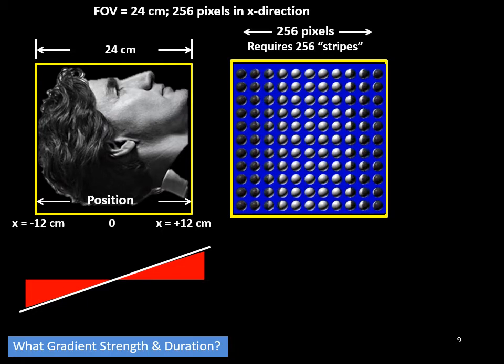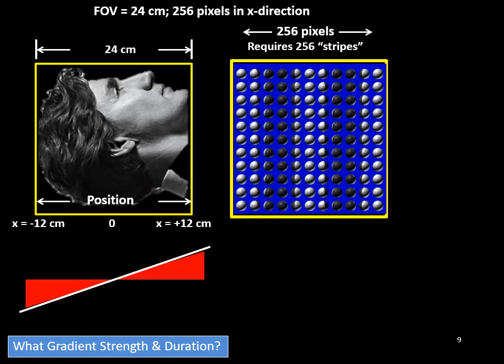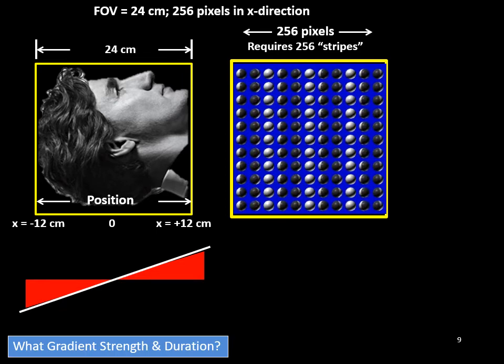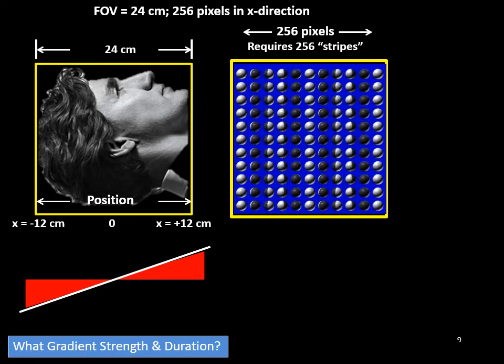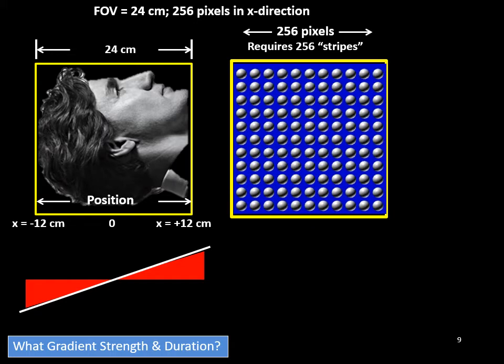It doesn't rotate. But to get 256 lines across the image, we would have to have the spinning ball on the extreme left of the image rotate 128 times relative to the center ball, and the one on the extreme right rotate 128 times in the opposite direction to achieve that spatial resolution.